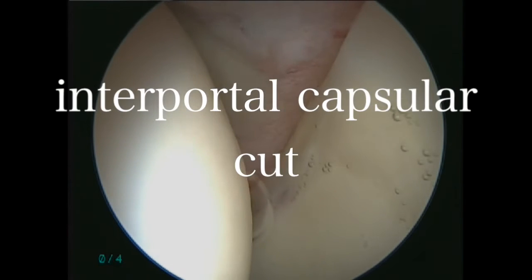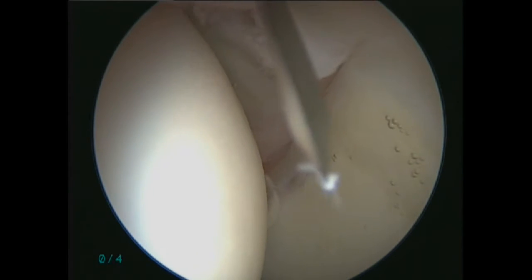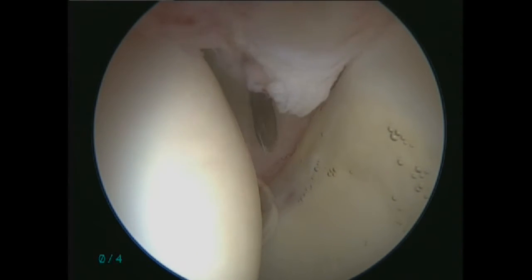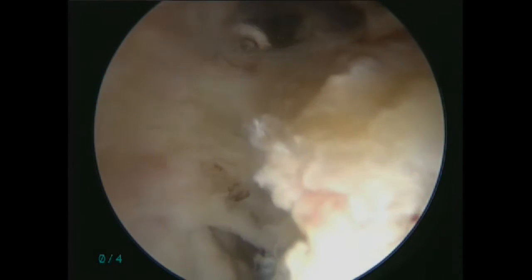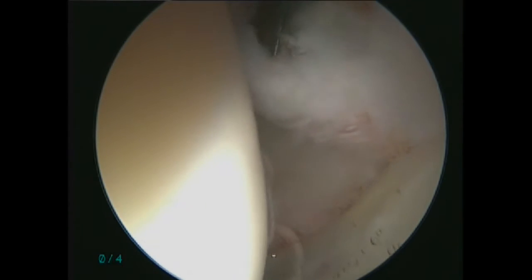Scope viewing from the anterolateral portal. An interportal capsular cut using a beaver knife and RF probe was performed to improve the accessibility of the scope and surgical instruments.